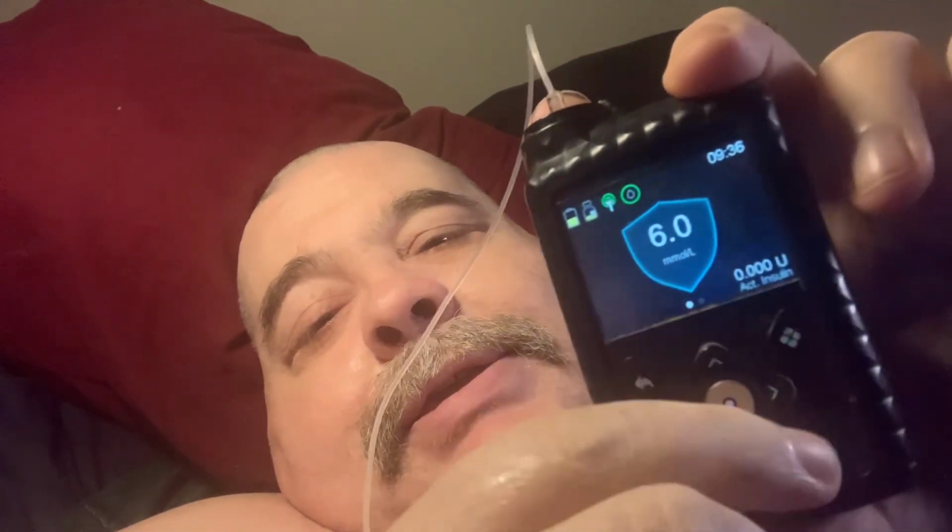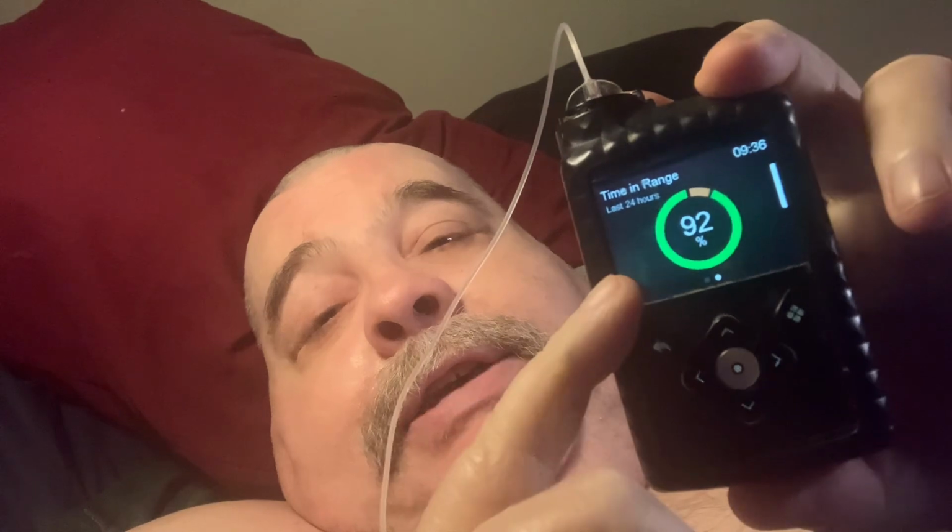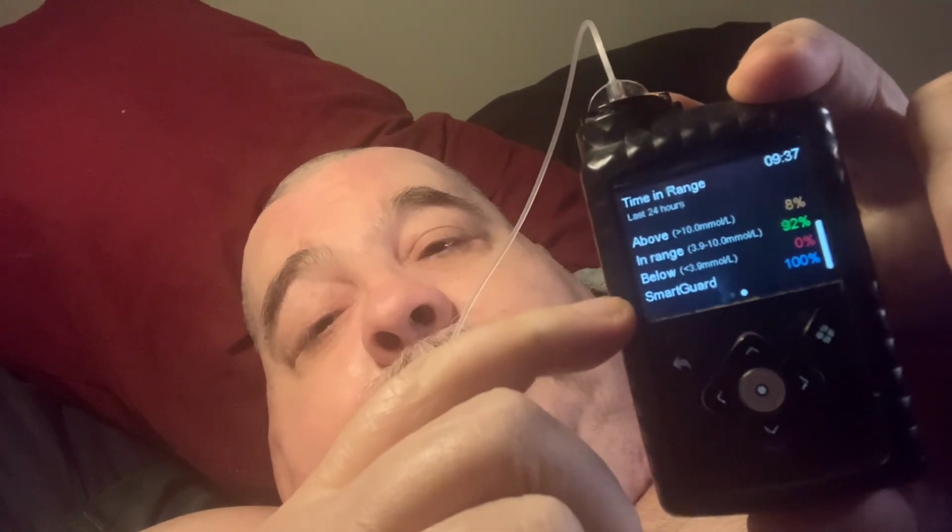I figured it out. Sorry, it was the wrong screen. This screen, go here, and then that'll give you your rate for the last 24 hours. In the last 24 hours, I've been at 92% time in range. We go below again, and it breaks it down for us.